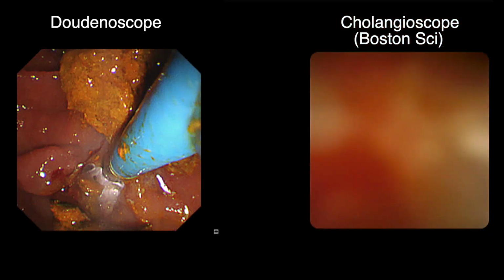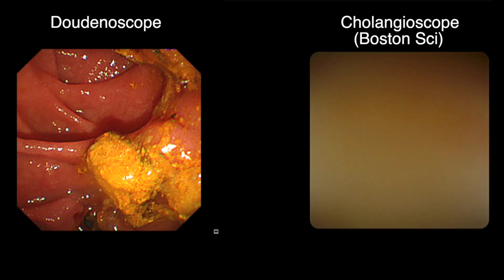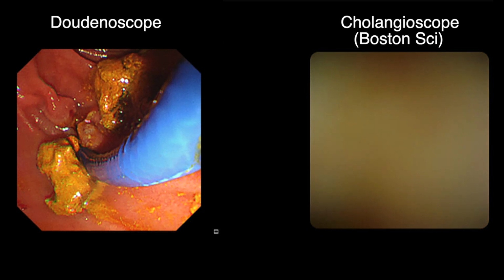I now introduce a Boston Scientific Spyscope into the bile duct over the guide wire.